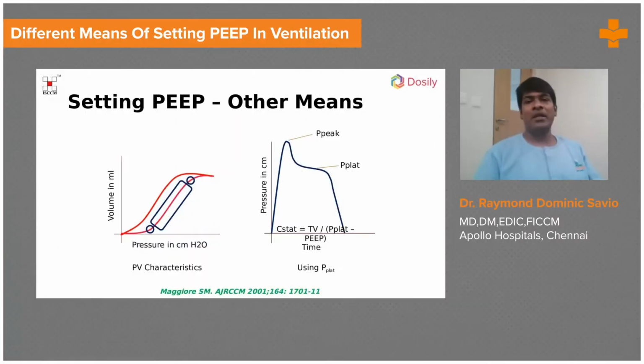There are many better ways of identifying PEEP, just for you to know. If you are a novice, please don't try fidgeting around with all these things. The first one is a funny graph over there that's supposed to be an animation. Excuse me on that.